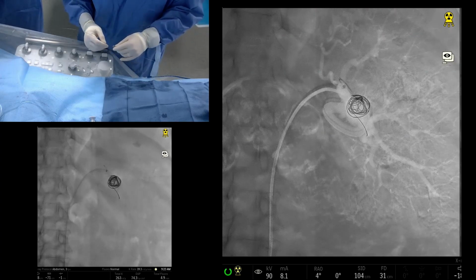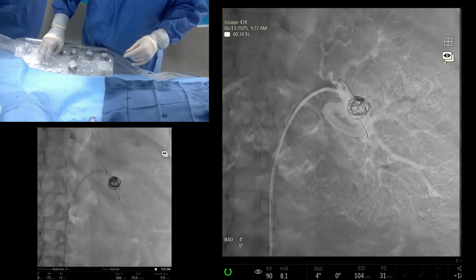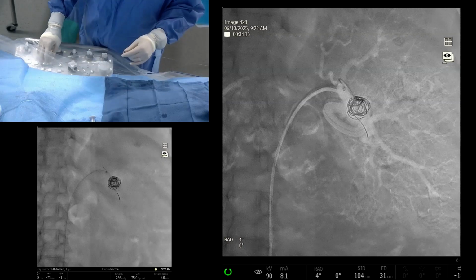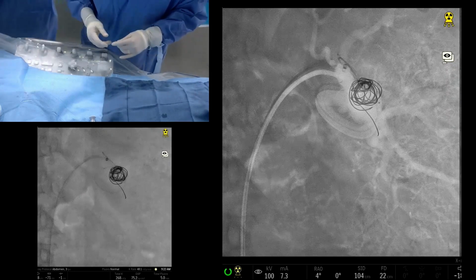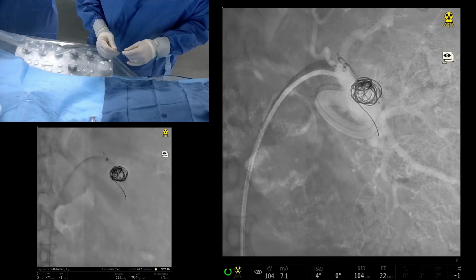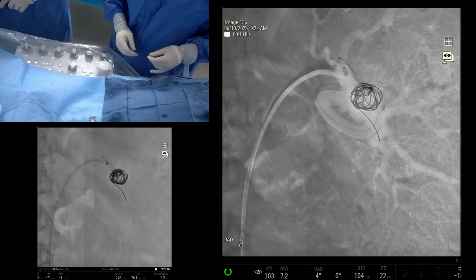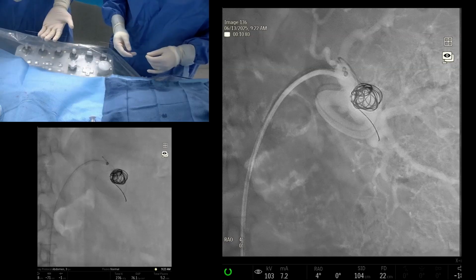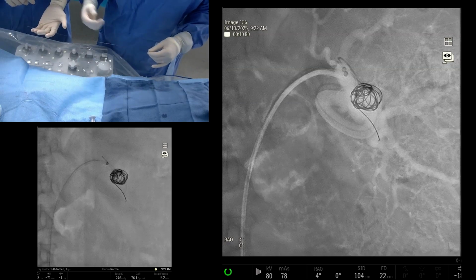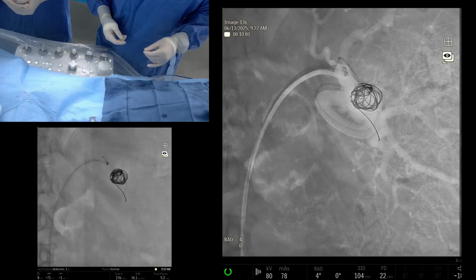Now, it gets a little bit messy here, I will admit, because I've implanted my microcatheter into the aneurysm sac. And as we push more of the coil out, it's sometimes quite difficult to see the tip of our microcatheter. Maybe that's potentially why Emil might prefer something like a pushable coil, because that way it's completely out. Here, it's a detachable mechanism. You can still push it out if it's still left in your microcatheter, but the whole point is to position as you see fit, and then ultimately detach it.